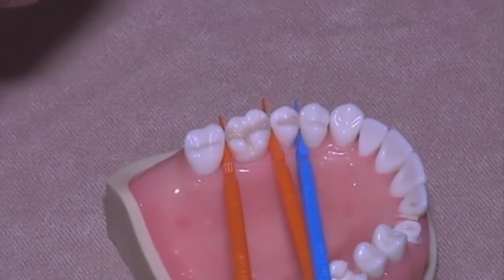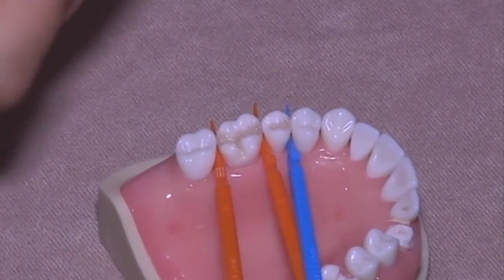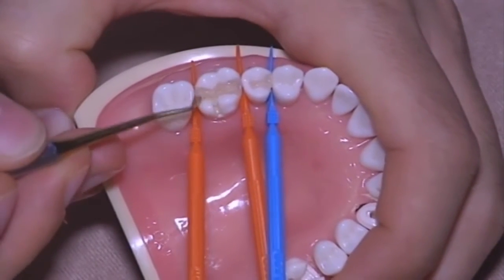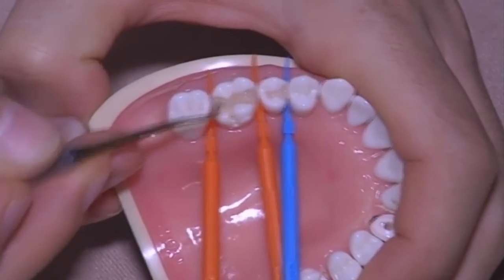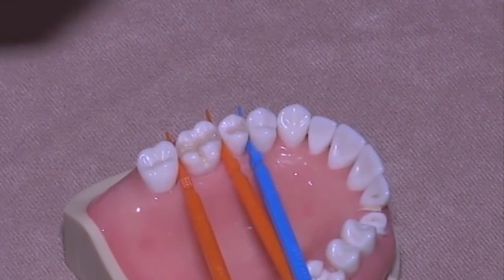And now, last dentin layer. Again, first pushing down the composite in order to close all the cavity.